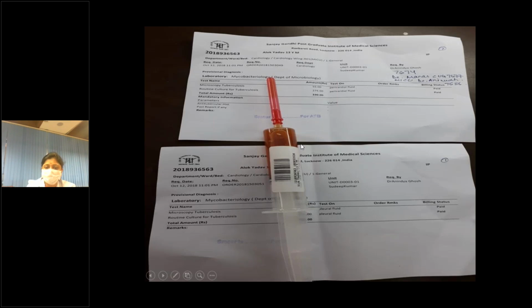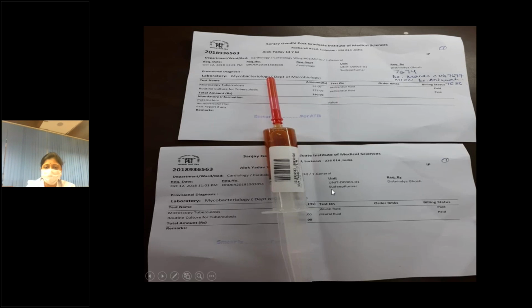As an example, I would like to show you two forms with a single sample that has been collected from a patient, and the test on reads pericardial fluid as well as pleural fluid. Now, on a half day Saturday, we received the sample in the laboratory with two forms and no clue as to whether it was a pericardial fluid or a pleural fluid. On calling up the concerned resident on the CUG, we were told that he has absolutely no idea and someone else has used his login and password, which is the most common answer that we get upon inquiring about that sample or patient.